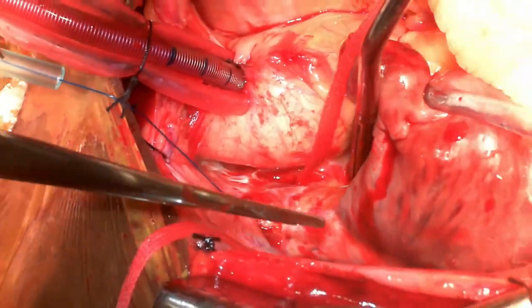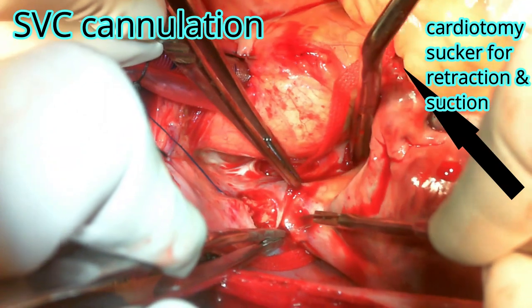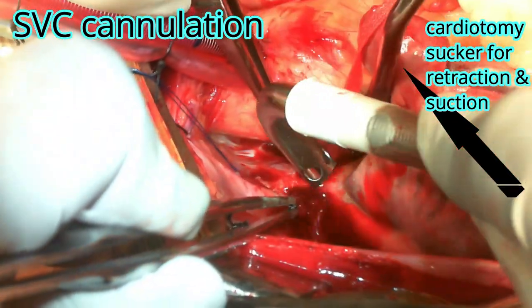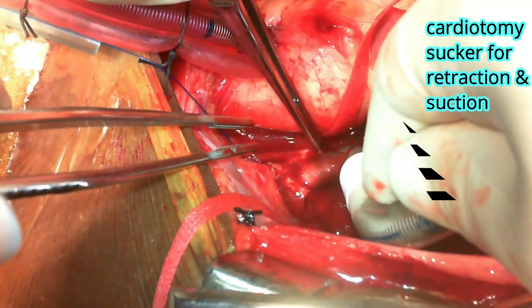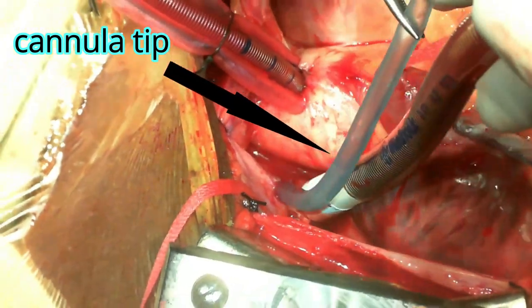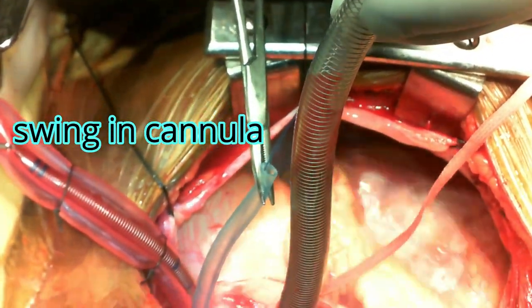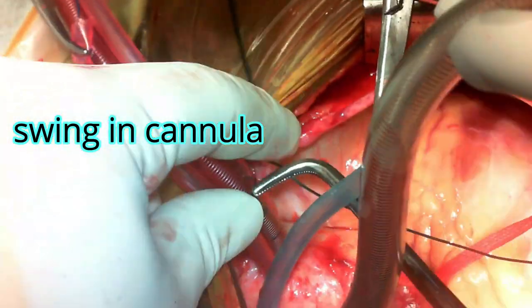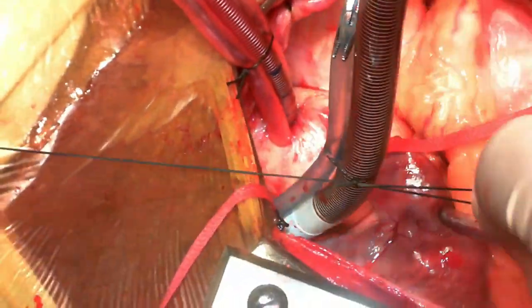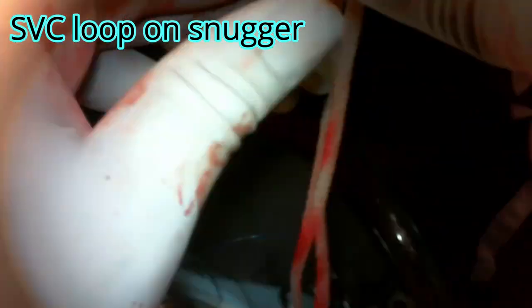SVC cannulation comes first in a clear-cut scenario. The assistant holds one limb of the purse string, the surgeon holds the other, with a cardiac sucker in the transverse sinus as you pass the venous cannula. Always make sure the marker is towards the anesthetic side. Make an opening snug enough for the cannula — if you make a bigger hole, you may get an airlock. Always look for the swing in the cannula, which is possible only when the patient is ventilating, confirming the cannula is within the SVC. Put the caval snares into the snuggers and connect the SVC cannula to one limb of the CPB circuit.